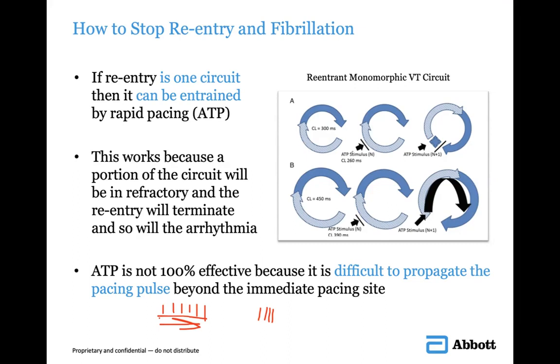Okay. To add to that point, you may also see it sometimes as a bridge during extractions. So a patient has an infected device and they don't re-implant right away. They may give them a wearable just for the time as they get the infection under control before re-implant. Okay. So there's no specific indication apart from using it as a bridge before implant of an ICD.